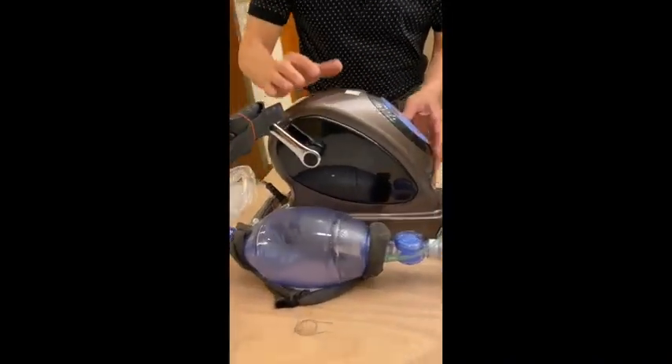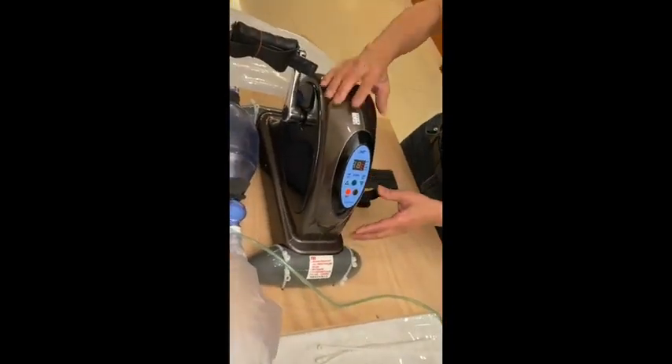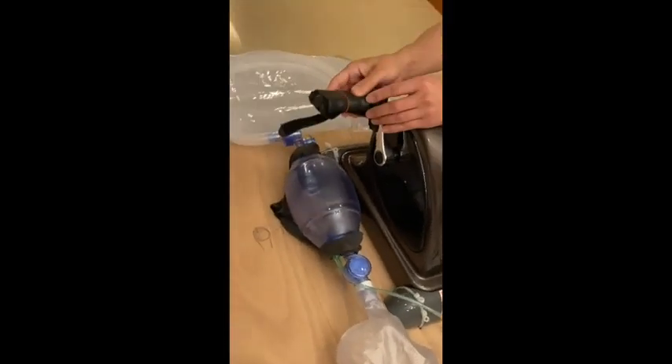First, you will need an arms and legs motorized arms and legs exercise machine, a pump ventilator, and later I will show you the pedal assembly.